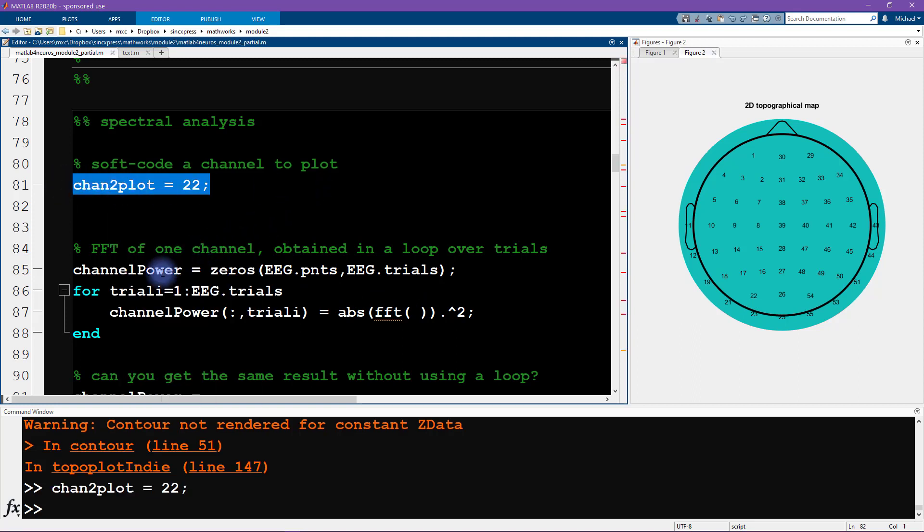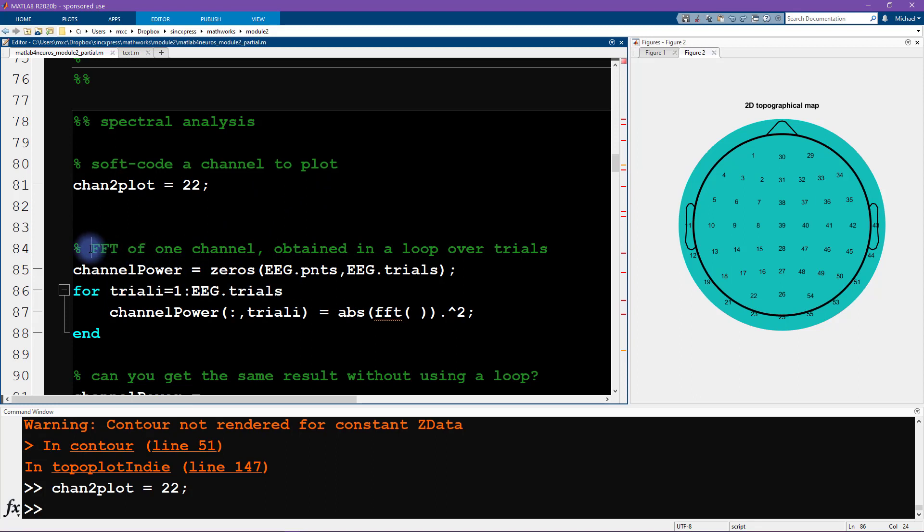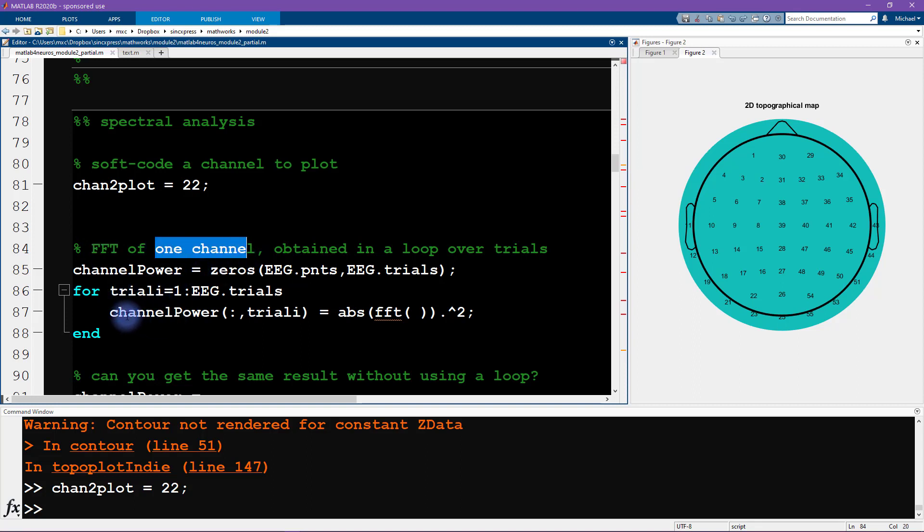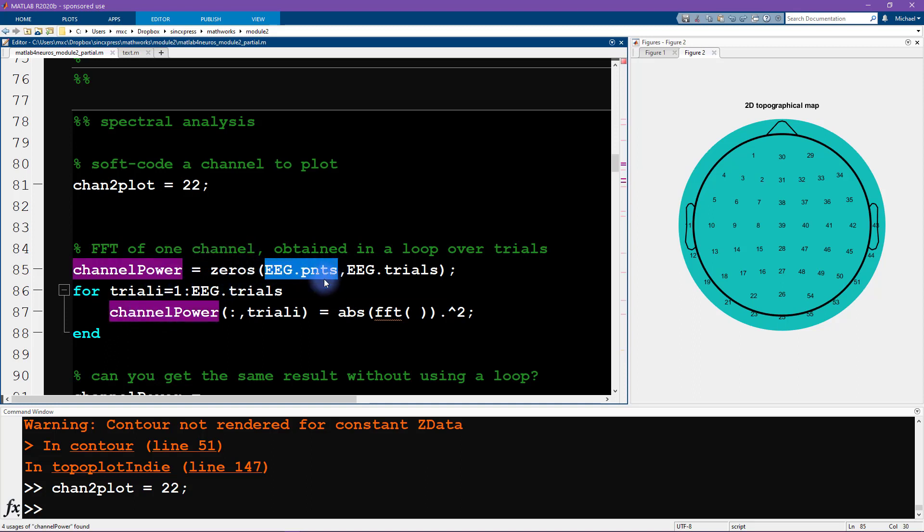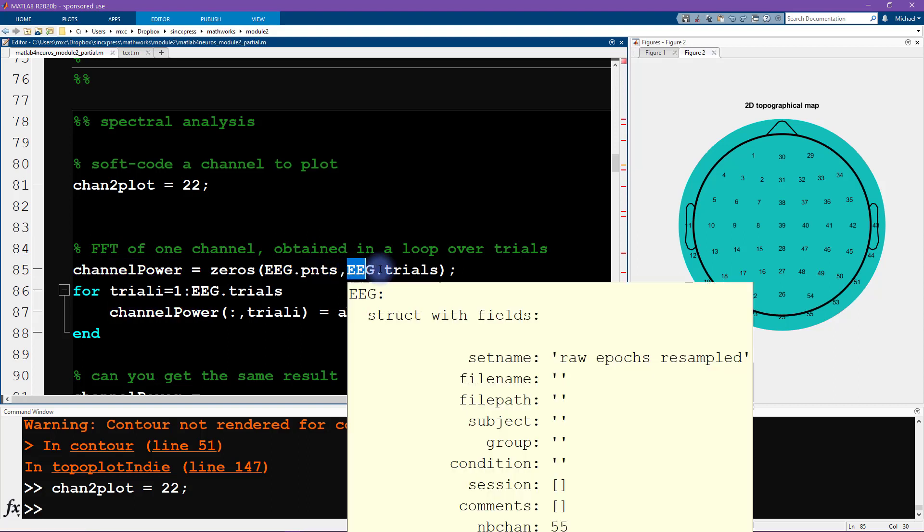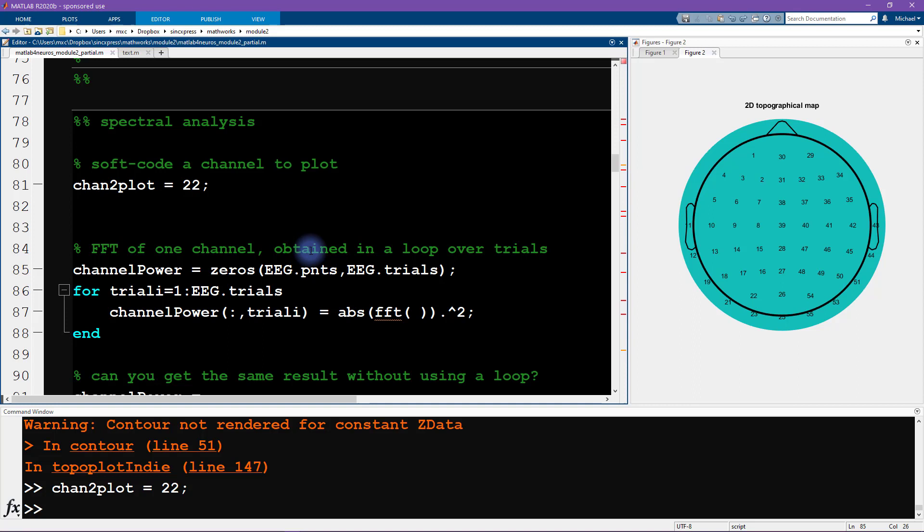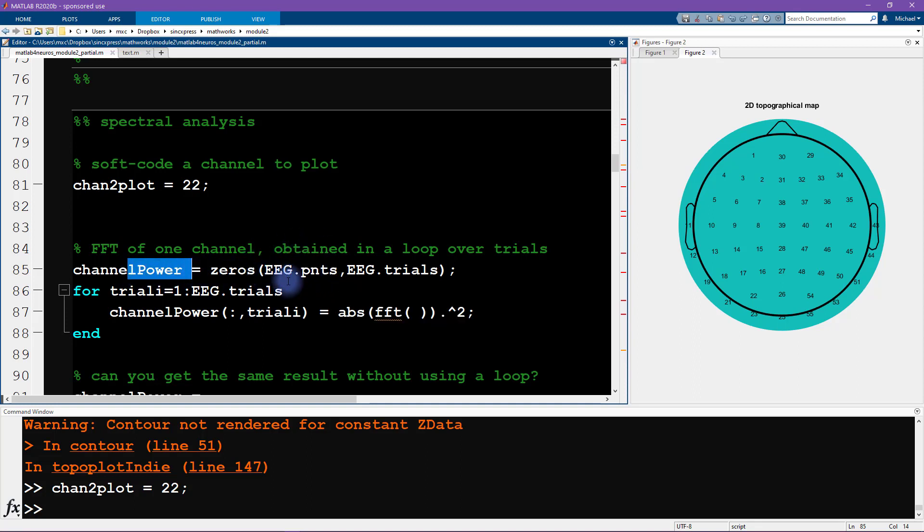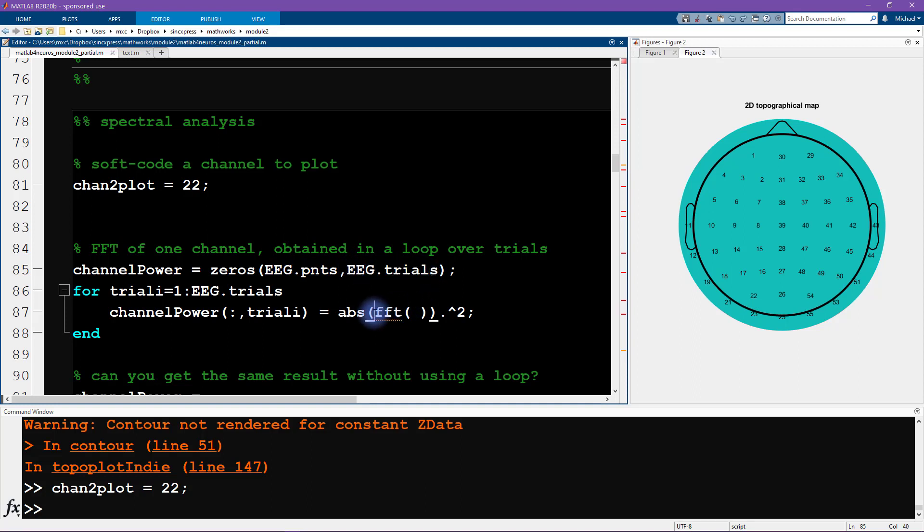Here we have a loop over trials where we are going to compute the FFT, the fast Fourier transform of the data from one channel, and for each trial separately. We initialize our matrix here, channel power. You can see this is the number of time points by the number of trials or stimulus repetitions. Now it turns out that in the Fourier transform, the number of frequencies you get back corresponds to the number of time points in your signal.